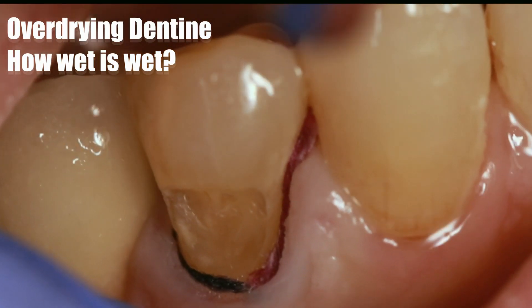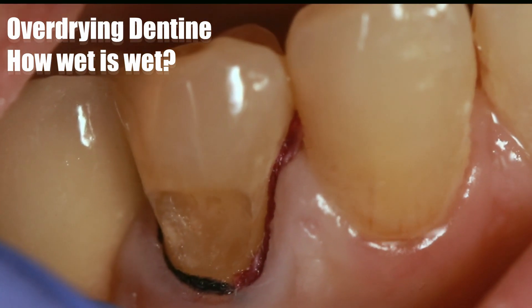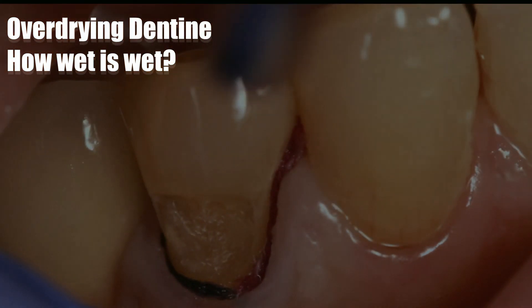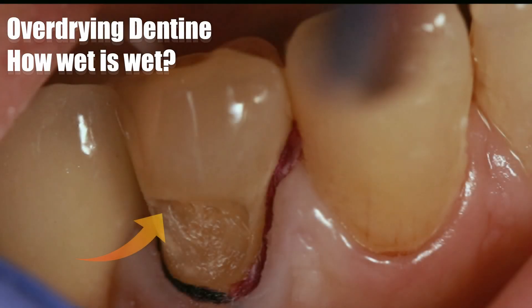Understanding the principle of overdrying dentin is only difficult if you are looking with your naked eyes. If you're looking with magnification, the effect of desiccating the dentin is going to be really evident.